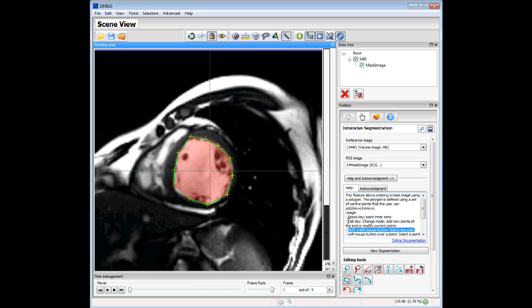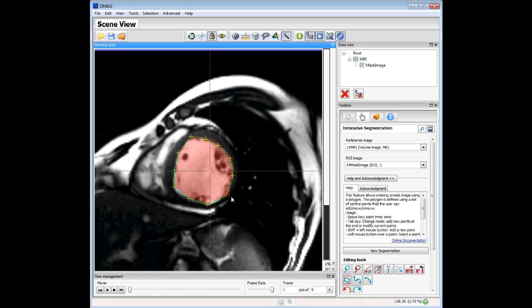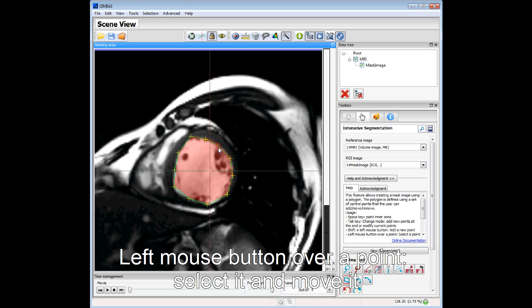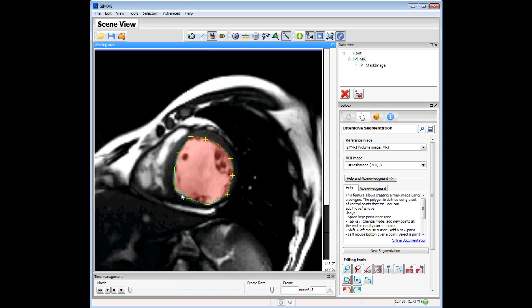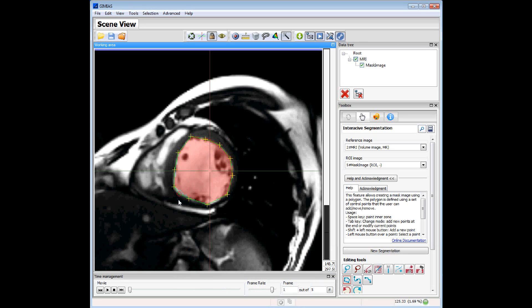We can press the Tab key to switch to modify the control points. We can click on a point to select it — you can see it turns red. We can move it to place it in another position, or we can add a new point by pressing Shift and left mouse button. Then press Space to paint the inner zone.